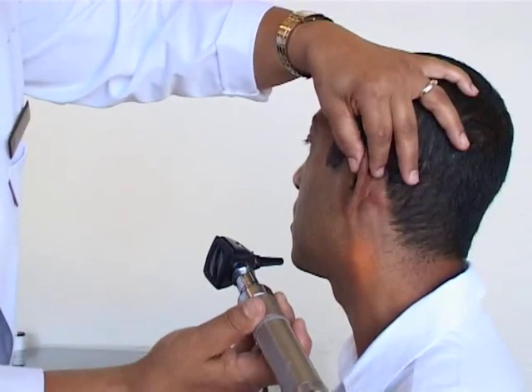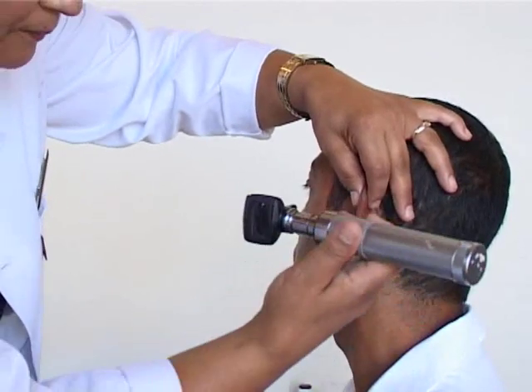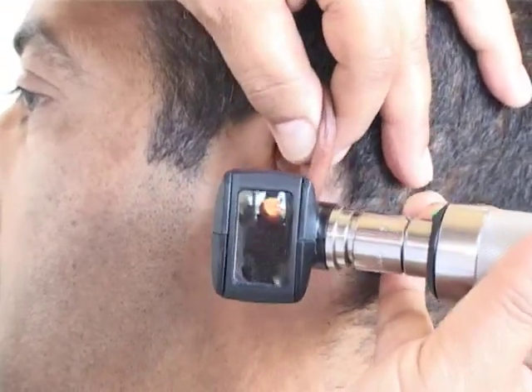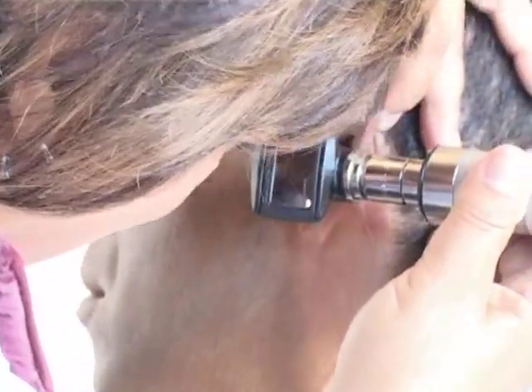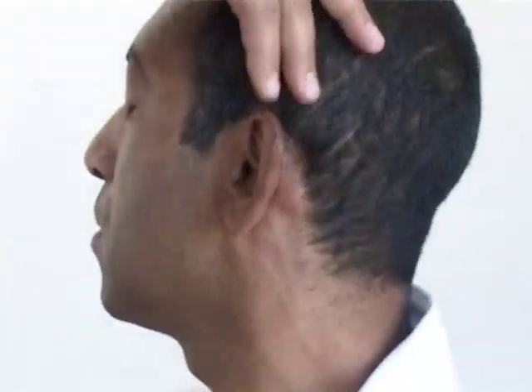We pull the ear up and back for the adult to straighten the ear canal so that we can focus on the tympanic membrane. We insert the otoscope carefully and inspect. When we do the inspection of the tympanic membrane, we look for the following normal findings: the colour of the tympanic membrane is supposed to be pearly grey, shiny and transparent.